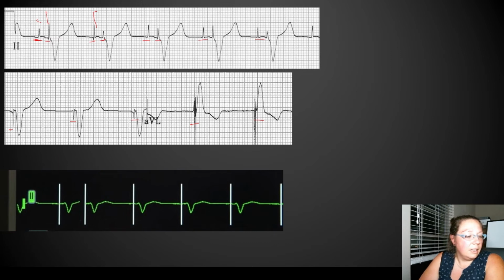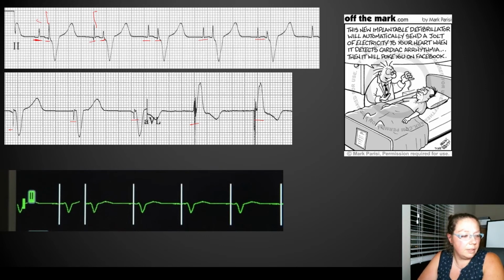pacer impulses, electrical impulses. But this is what you're going to see, these pacer spikes, and they're just going to look like lines. The monitors I have at work just have a line where the leads pick up the electrical impulse. I think I have a cartoon too. Yep.